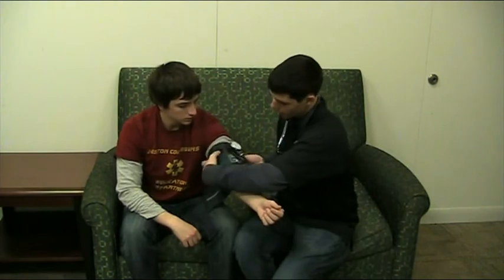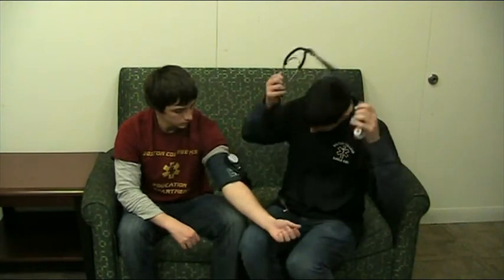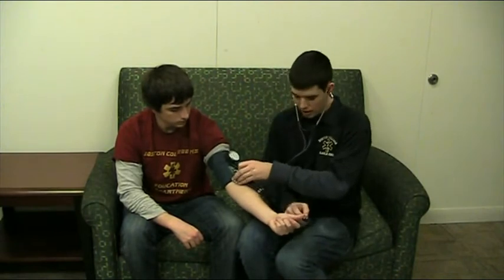There are several simple steps you can take to adequately assess the patient's blood pressure. The first step is to put the BP cuff on. You can typically put it over a thin shirt or the patient's bare skin. Find the patient's artery and put the BP cuff on so that the label that says artery is pointing down at it. Put the stethoscope over the artery. Tighten the bulb and begin to squeeze. The needle should go past 180 millimeters of mercury. You might need to go further if the patient is hypertensive.